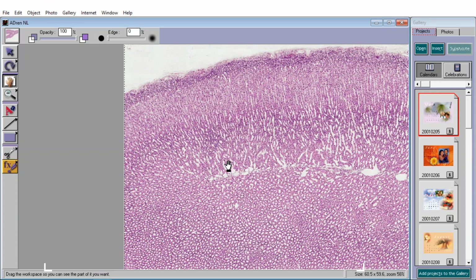In fact, if you wanted to, you could probably estimate the number of cells in this whole cortical layer. And I can also tell you that if you put an actual measuring stick against it, it'd be about 1 millimeter from here to here. So the normal approximate thickness of the adrenal cortex is about 1 millimeter. And if you looked at it grossly while you're measuring it with your measuring stick, it would be yellow, because all of the cells here are loaded with cholesterol, which is a fat, whether you're making primarily glucocorticoids in the thickest layer, or mineralocorticoids in the subcapsular glomerulosa layer, or sex corticoids, androgens, perhaps estrogen-like compounds in the deepest layer.